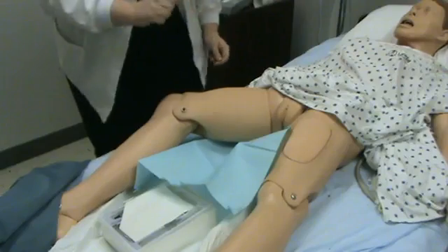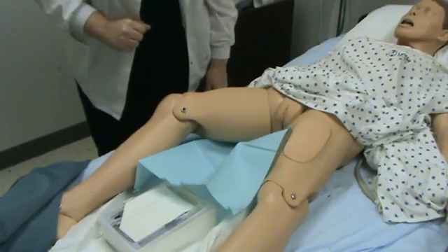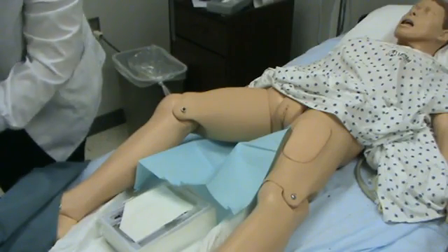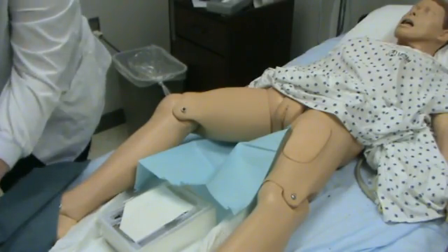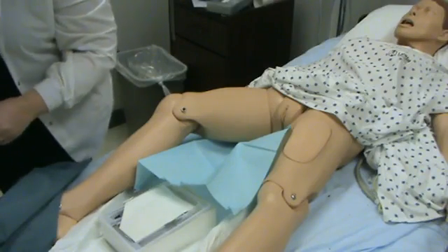Back up to your resident or your patient and drop the drape. Now in this case I can't get that under the patient correctly, so I am going to show you how to do it once I get my sterile gloves on. I am going to apply my sterile gloves. If you need assistance with sterile gloves, please go back and watch that video.